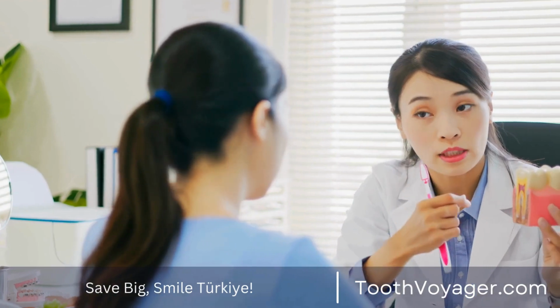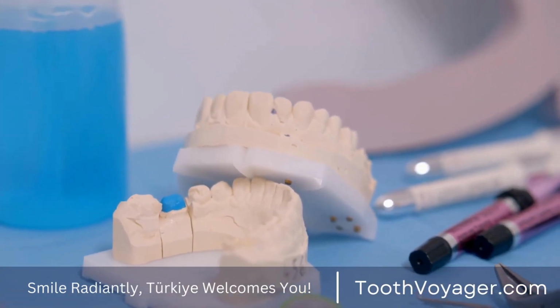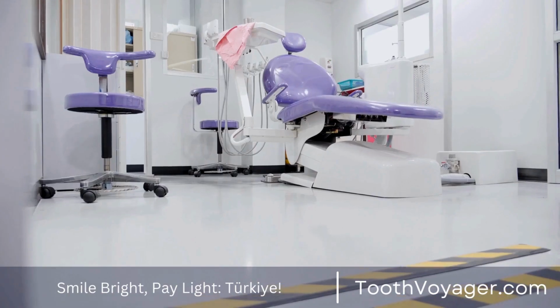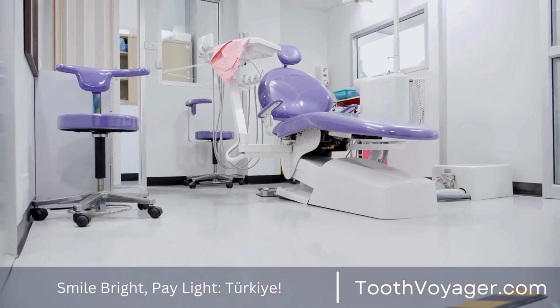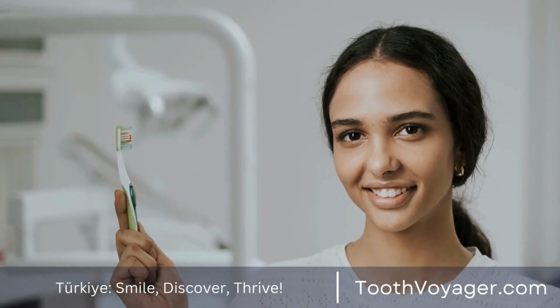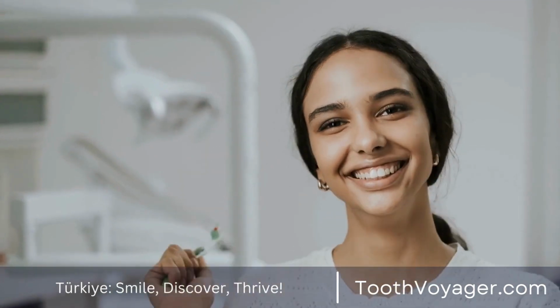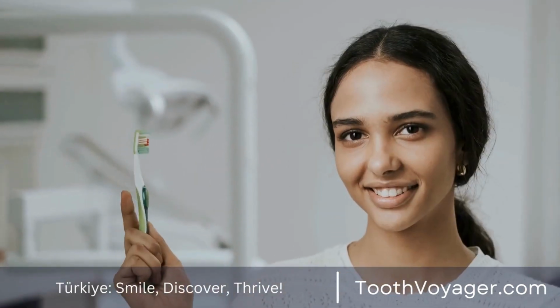4. The support of a dental bridge. Dental crowns are typically utilized to strengthen dental bridges. Dental bridges are a prosthetic device which is utilized for the replacement of some or all missing teeth. Dental crowns are put over adjacent teeth in order to give support to the dental bridge as well as to keep the bridge in the correct position.